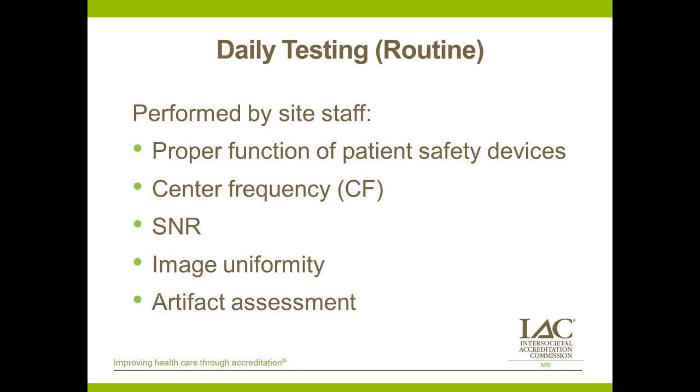And again, this is going to refer to testing that's designed to be done by an MRI technologist, by an on-site MRI equipment operator. So this is not referring to testing that's done periodically by a third party, such as a service engineer or a physicist. So these items under routine testing are going to be considered the responsibility of the MRI facility's technical staff.